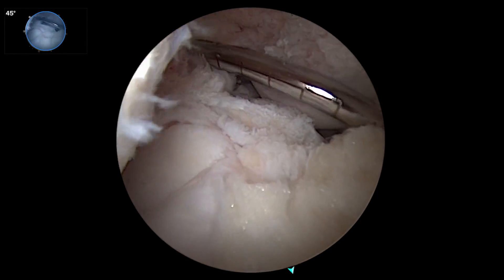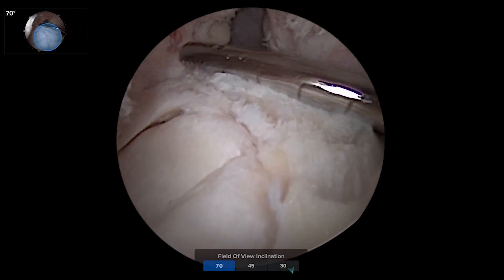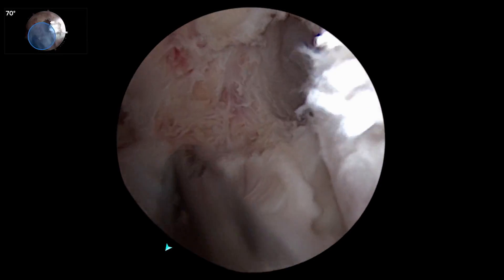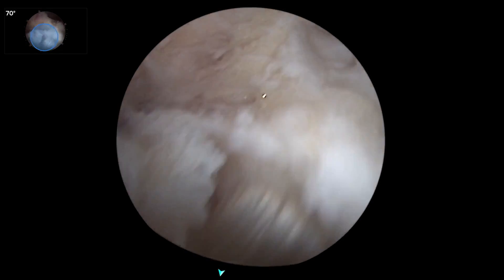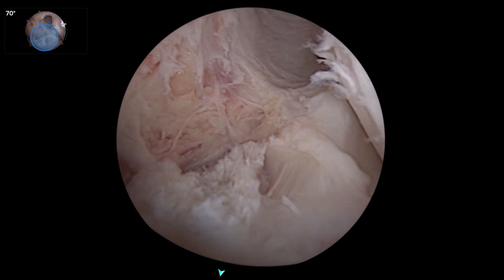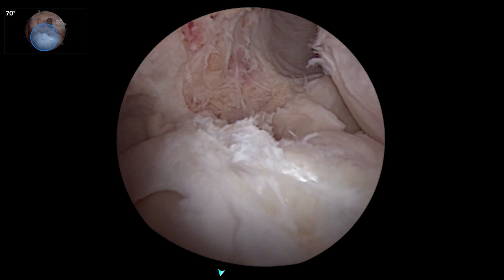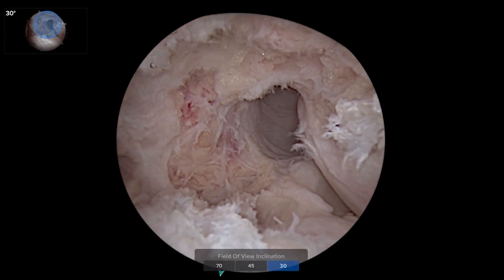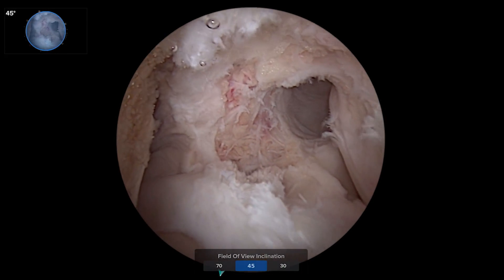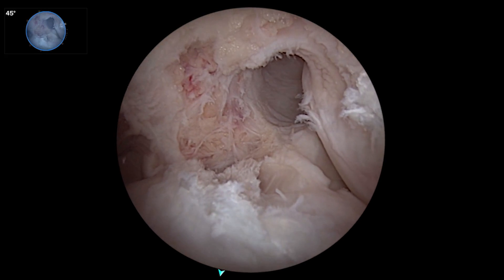Now looking down with the 70-degree view, with the straight shaver debriding, you can see the PCL tibial stump here. We can go down beside it and see all the way down right over at the posterior medial edge of the medial meniscus. This view right now is a 70-degree view I couldn't get without switching out scopes. The wide-angle view gives us the posterior horn of the medial meniscus, lateral meniscus, and PCL stump right there.